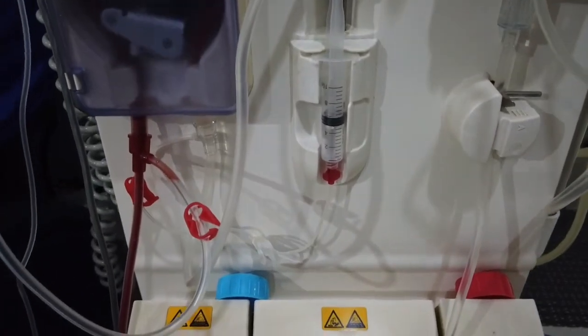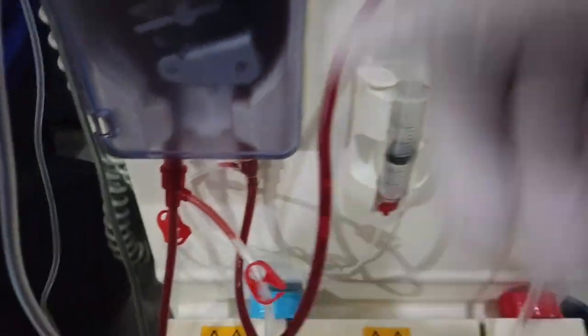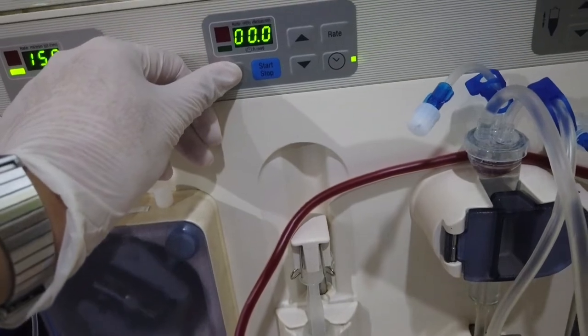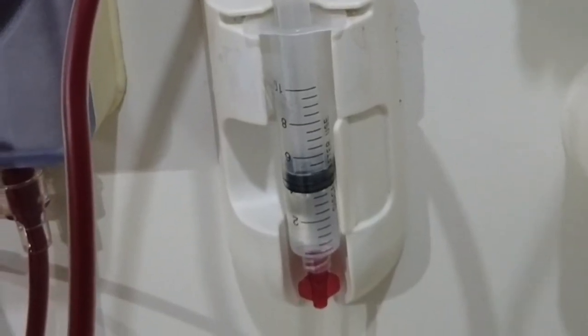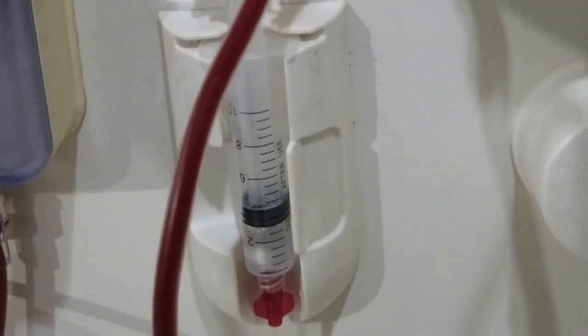Once blood passes beyond the blood pump segment, open the heparin clamp and long-press the bolus button to administer the ordered heparin bolus, and stop once the full dose is given. The order is 2cc heparin, so I stop until the level reaches 3cc, which means 2cc has already been administered.